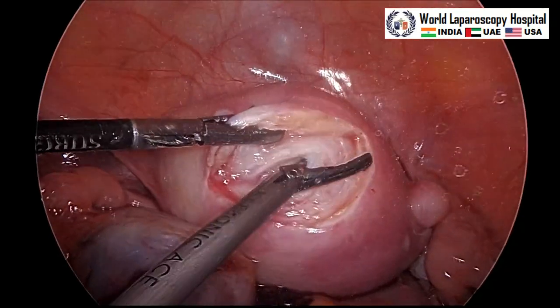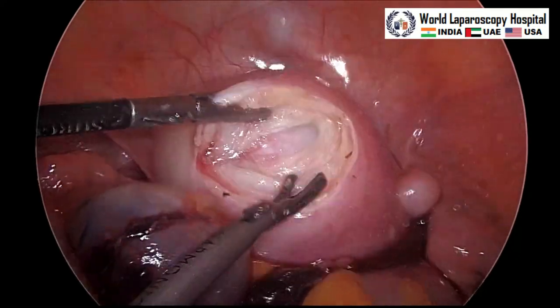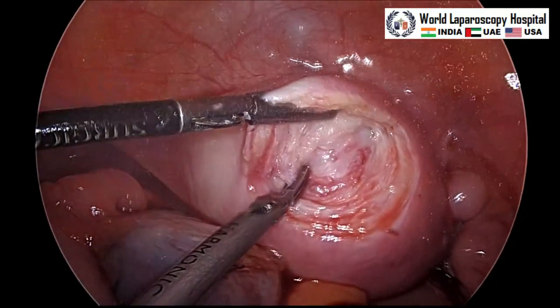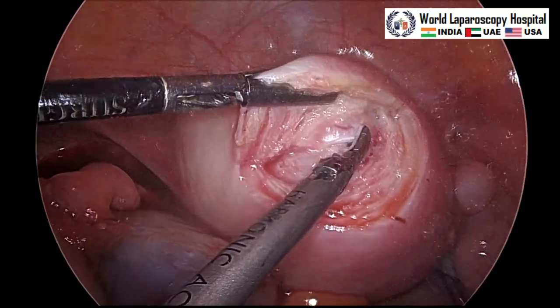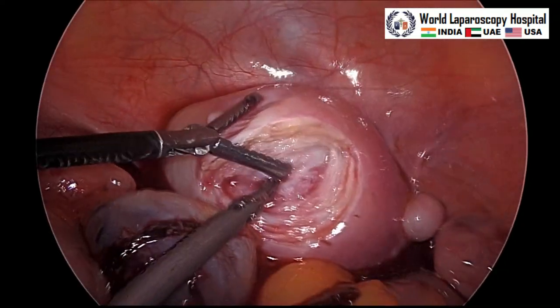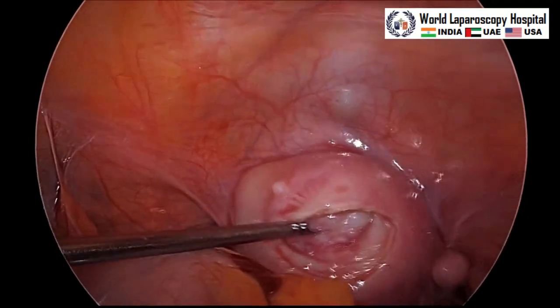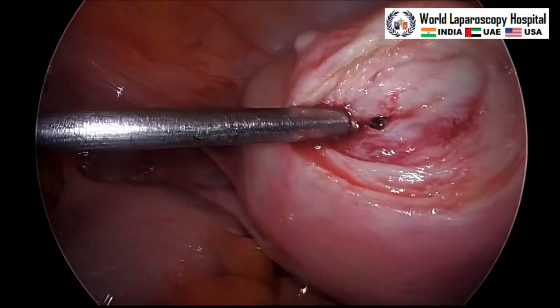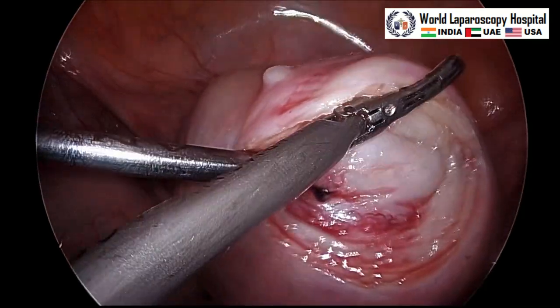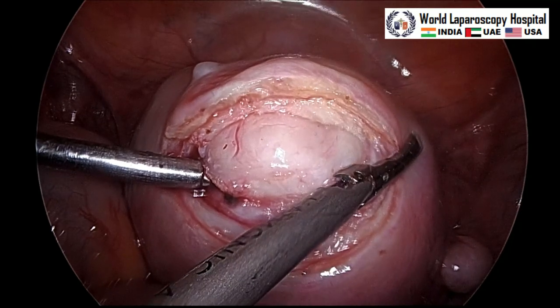We have to cut the muscle deep because it is a submucous myoma. And of course, the cavity will open in that situation. But with efficient suturing, it can be closed also. Now this is the time to introduce the myoma screw. The incision needs to be increased a little more because the myoma size is large. So a little more incision.